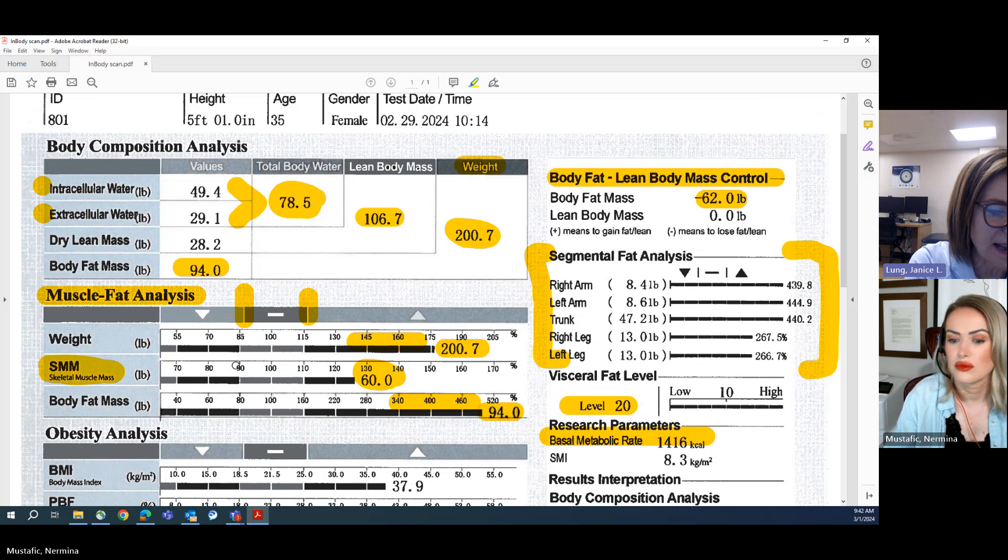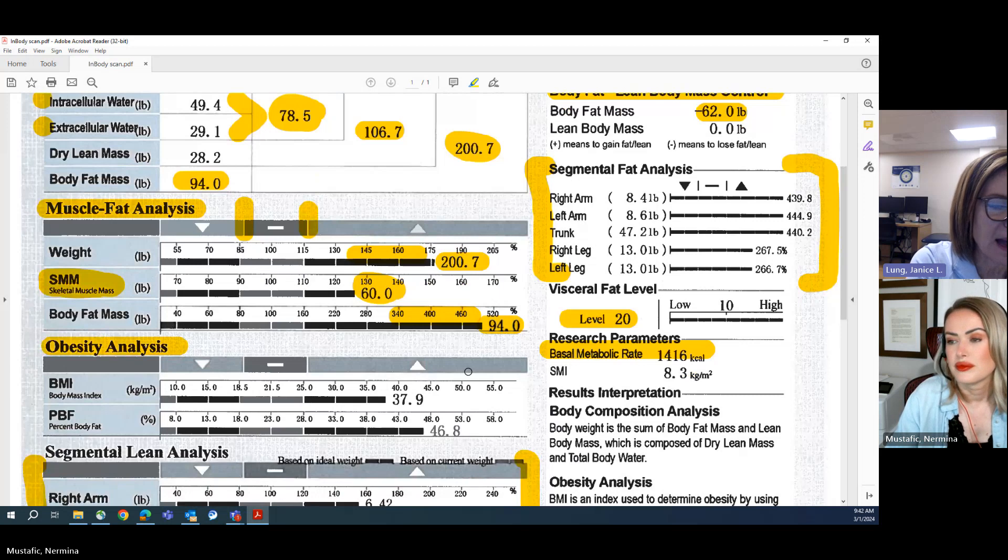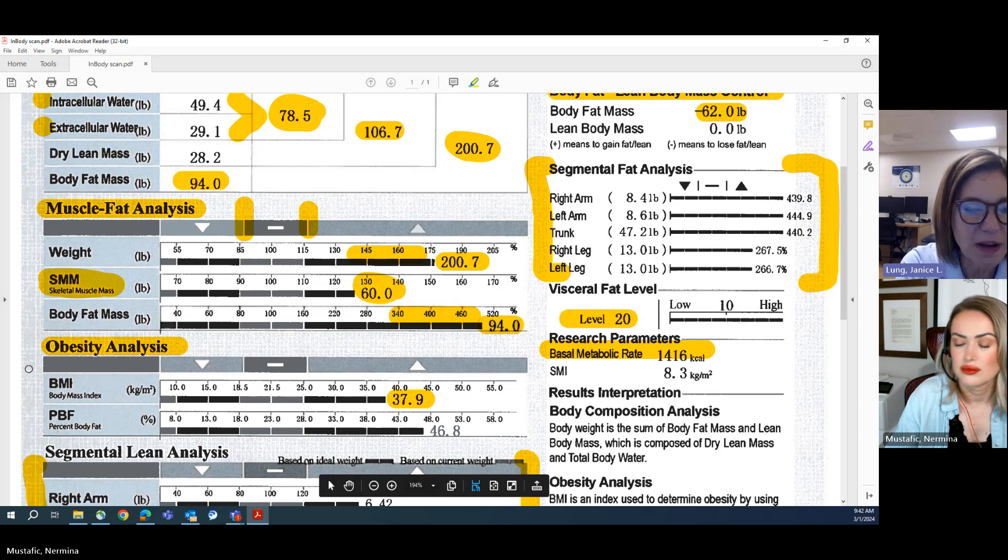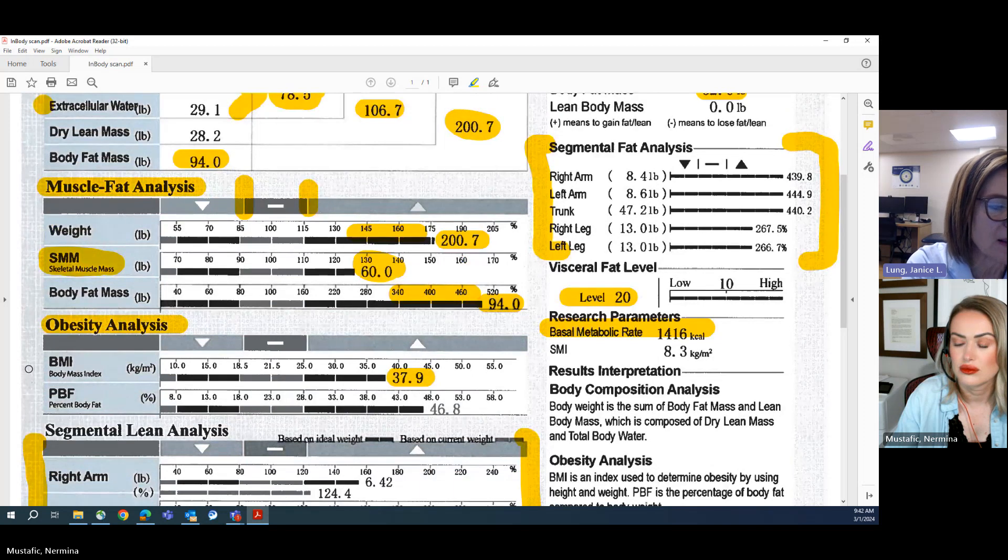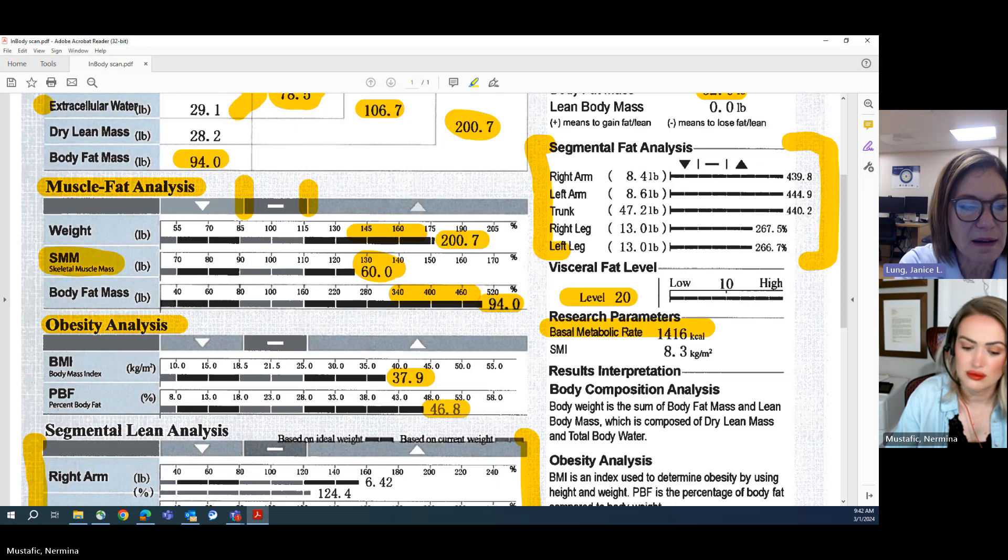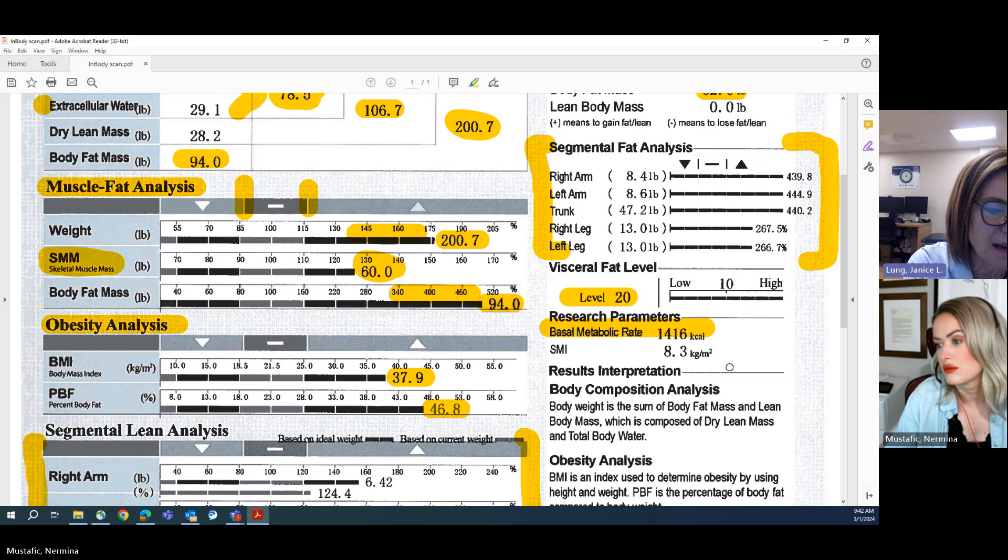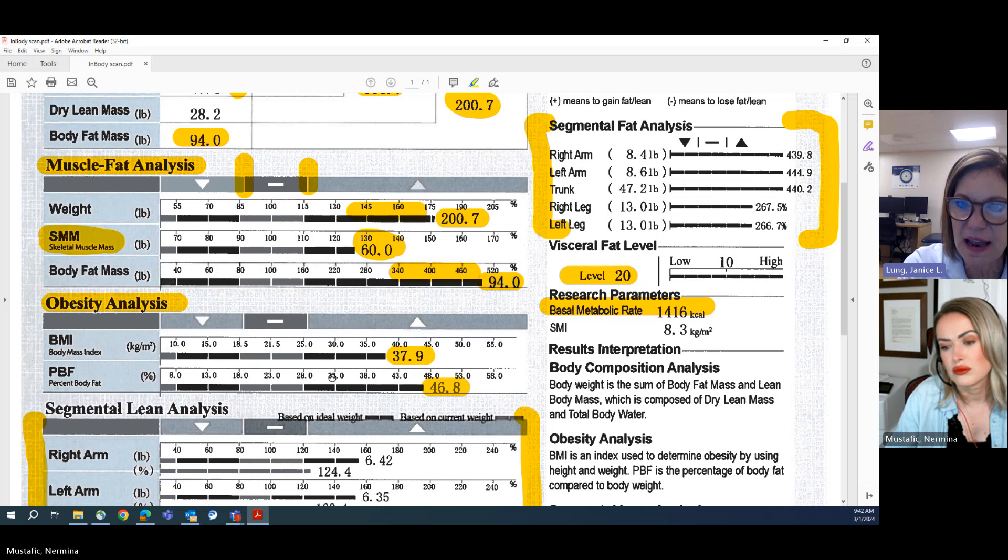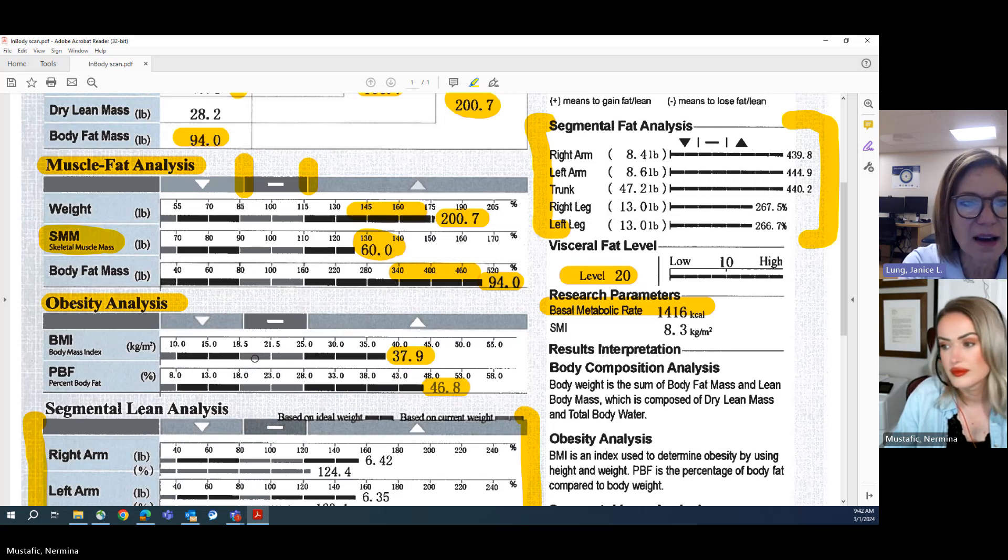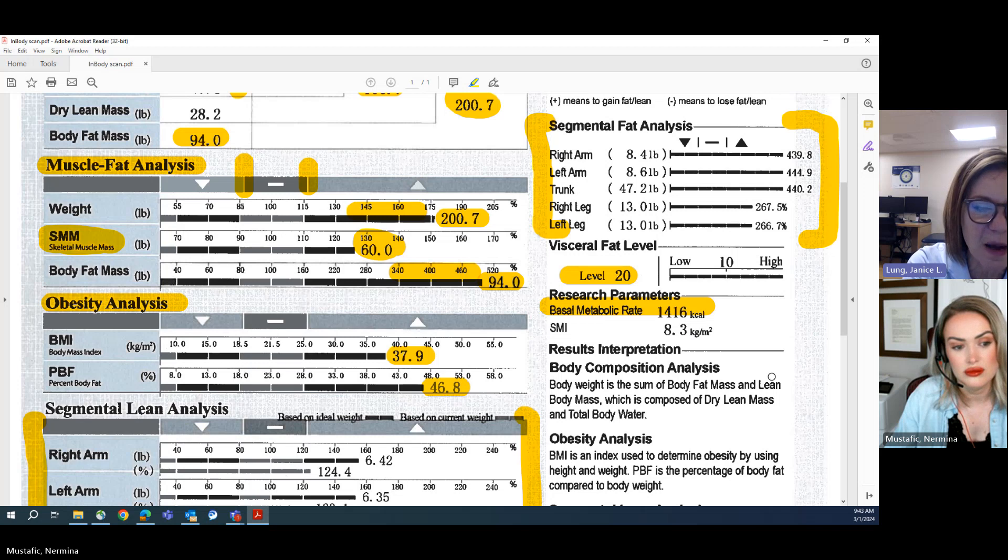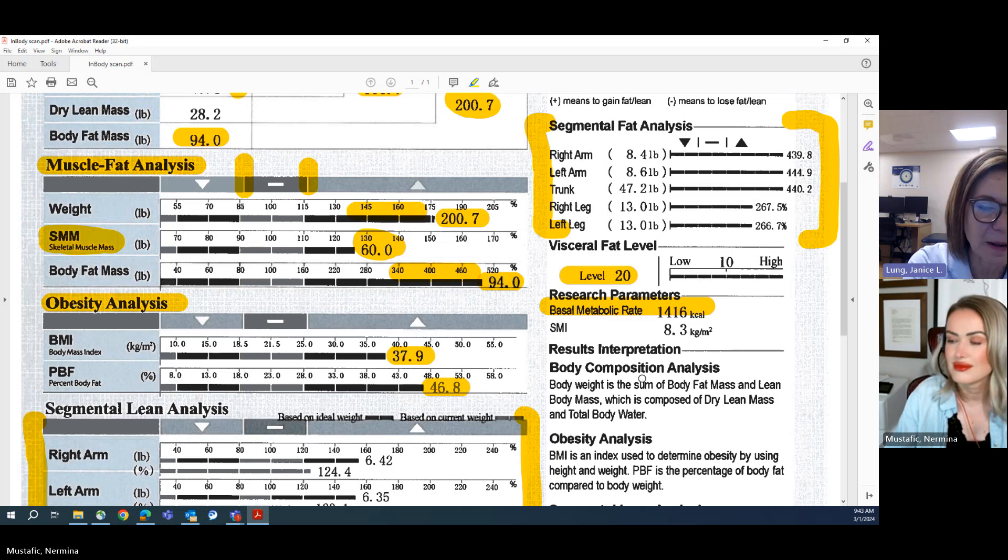Let's scroll down and look at that obesity analysis. We're also familiar with our BMI and nobody likes that because BMI doesn't differentiate how much of our body mass is made up of muscle and how much is made up of fat. What's much more valuable for us is our percentage of body fat, and there it is right there. It's a factor: how much of our weight, what percent of our weight is made up of body fat? For women, we'd love for our body fat percentage to be somewhere between 18% and 28%. And so as this person continues to take her steps towards weight loss, towards fat loss, she's going to find her body weight coming down. She's going to see that her body fat mass is coming down and that will be reflected in her percentage of body fat. So it's just pretty fun to watch that number come down. It'll go from 46.8 pretty soon. She'll see it at 46%, 45%, 44%. And that's pretty exciting.